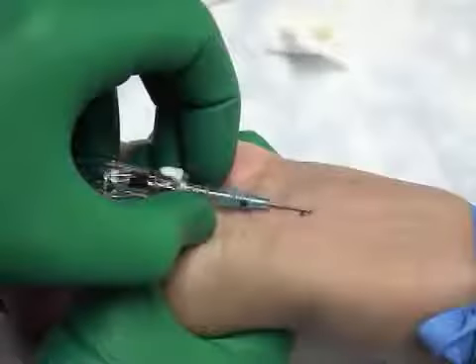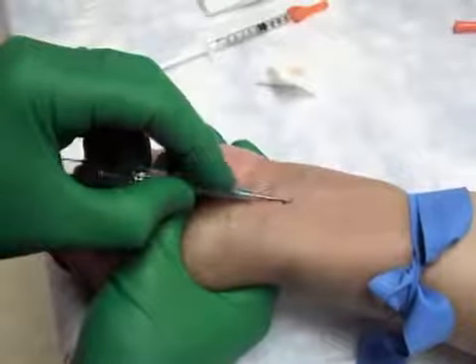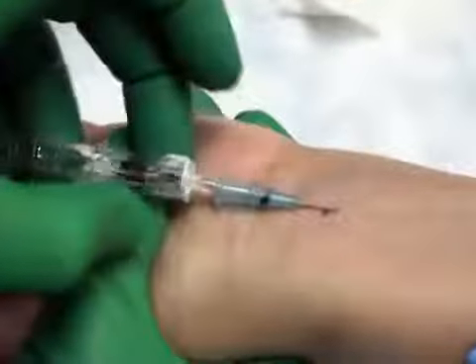Hold the end of the catheter with the thumb and index finger of your dominant hand. Maintain tension on the vein and the skin, stabilize the needle, and carefully advance the catheter into the vein. When the catheter has entered the vein lumen completely, remove the tourniquet.